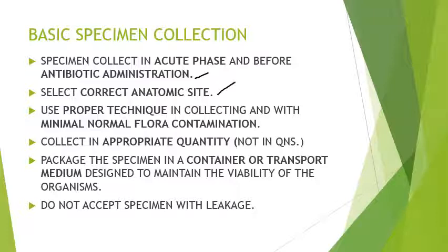Another, we select a correct anatomic site. Example, throat swab, swabbing. Another, rectal swab. So we choose a correct anatomical site. Another, we use a proper technique in collecting to inhibit normal flora contamination.